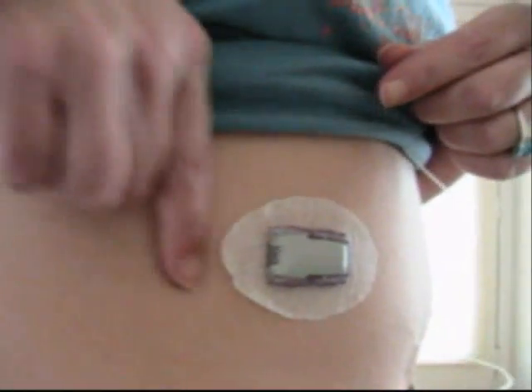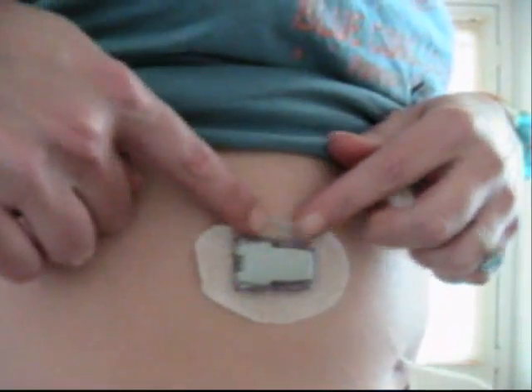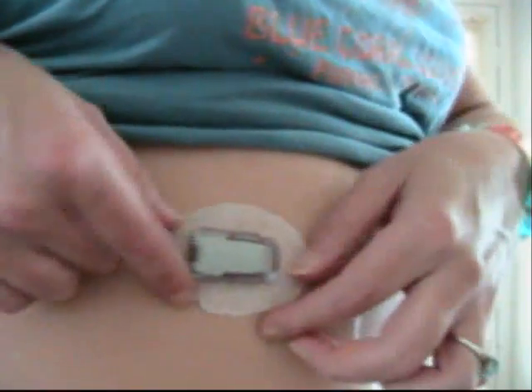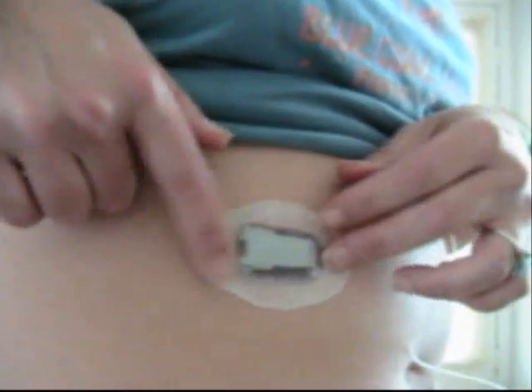So here's my sensor and you can see that it is not sticking too well. A lot of that fabric is coming loose, so I don't want to lose the life of the sensor, so I'm going to tape that down.